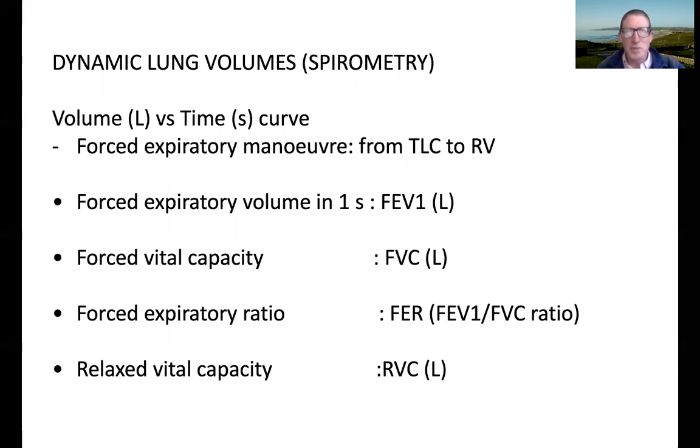This is spirometry, which measures dynamic lung volumes. Now, you will need to know about this. This is going to come up in exams, so listen up carefully. So what we're measuring here is volume against time, a volume time curve, a forced expiratory maneuver, all the way from total lung capacity to where you can't breathe out anymore, which is residual volume.